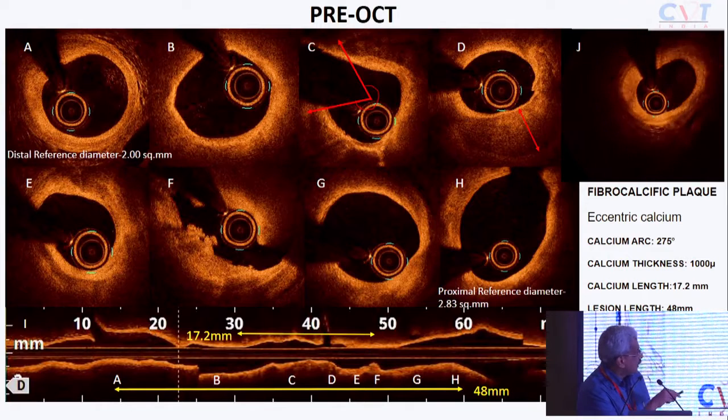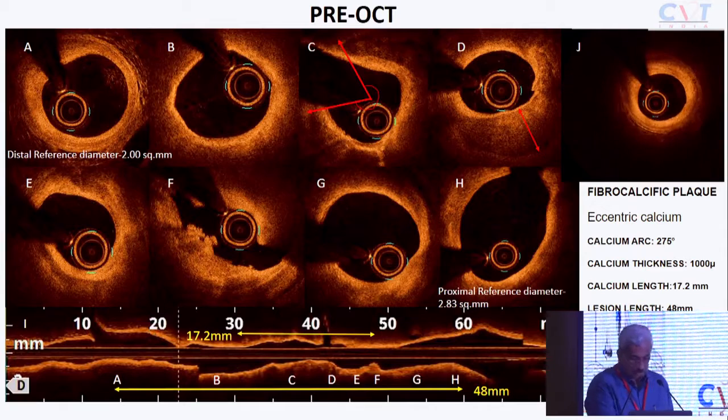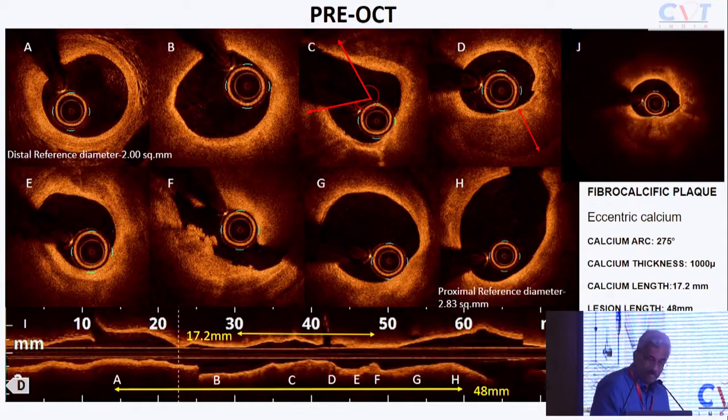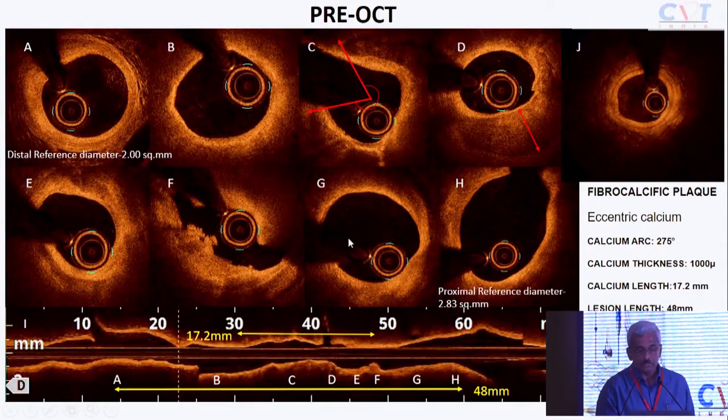So we start with level A, and that's distal.